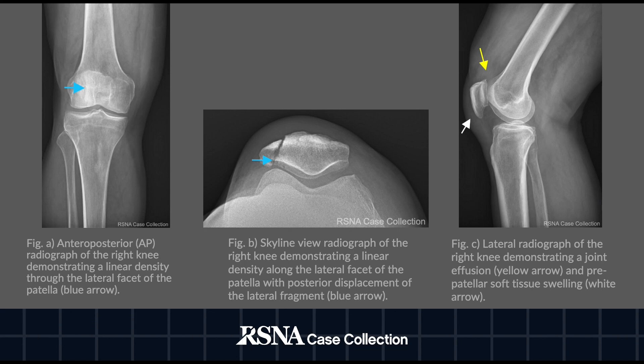The image on the left is an AP radiograph of the right knee demonstrating a linear density through the lateral facet of the patella, indicated by the blue arrow. The image in the center is the skyline view radiograph of the right knee showing the same linear density through the lateral facet of the patella. Posterior displacement of the lateral fragment can also be appreciated in this image. The image on the right is a lateral radiograph demonstrating a joint effusion indicated by the yellow arrow and prepatellar soft tissue swelling indicated by the white arrow.